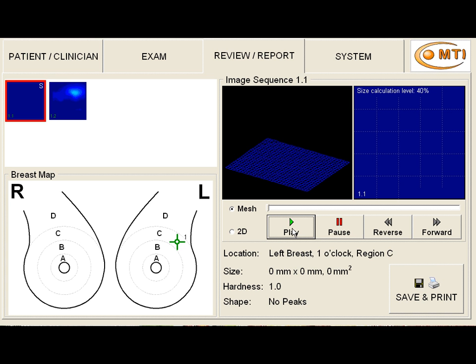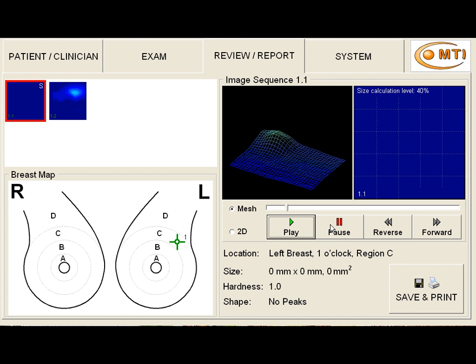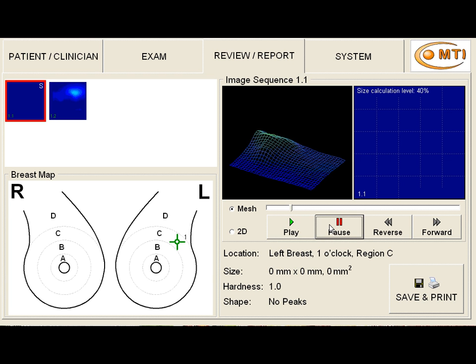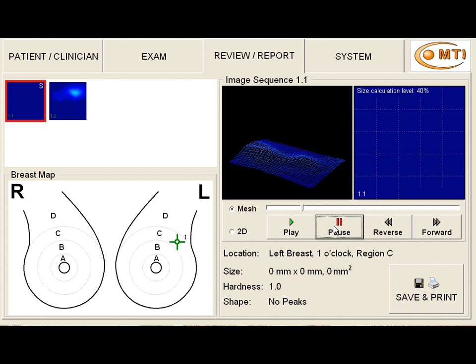Now let's look at that. Here, as we first start out, there seems to be a relatively larger wave. But it's just at the edge of the transducer. And it comes by and then it really is gone and doesn't return again.